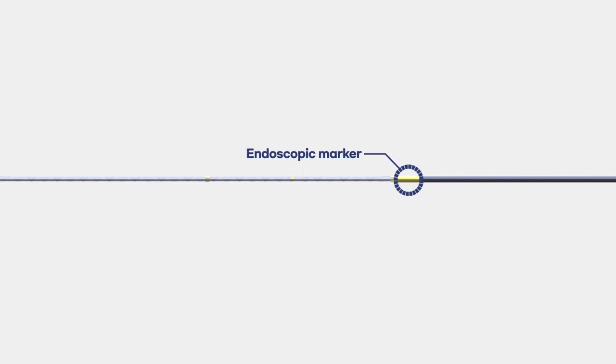The yellow endoscopic marker indicates the proximal end of the preloaded stent.